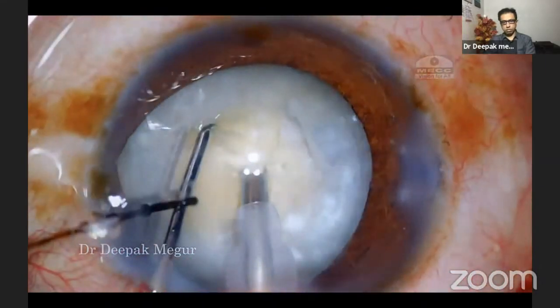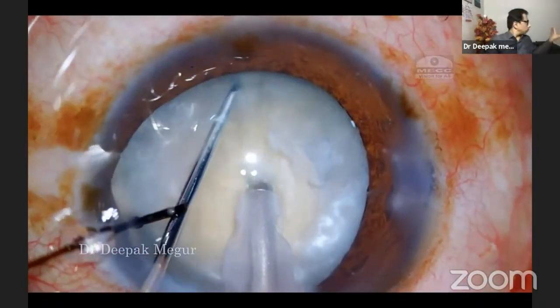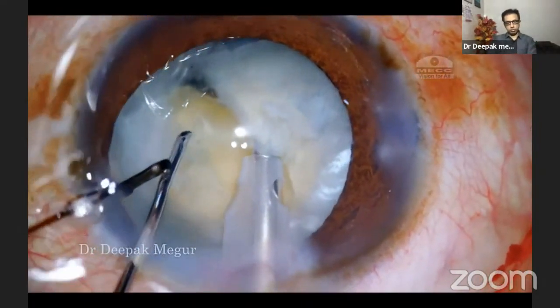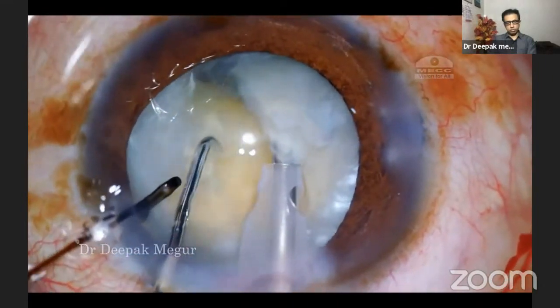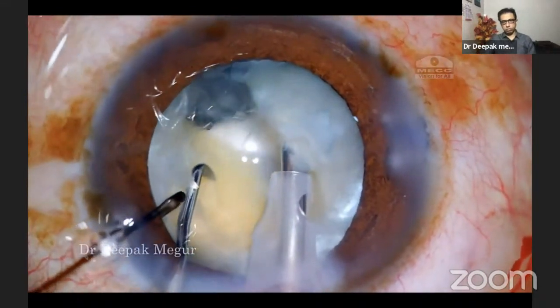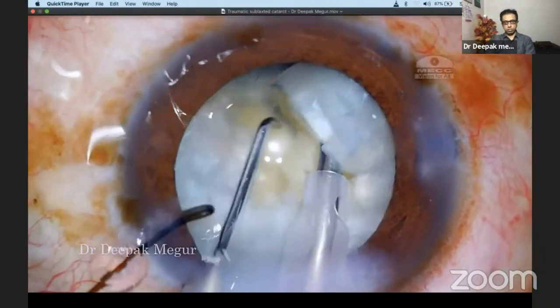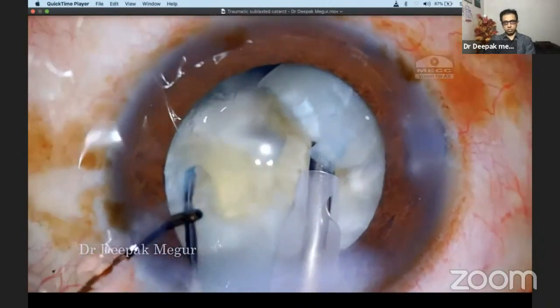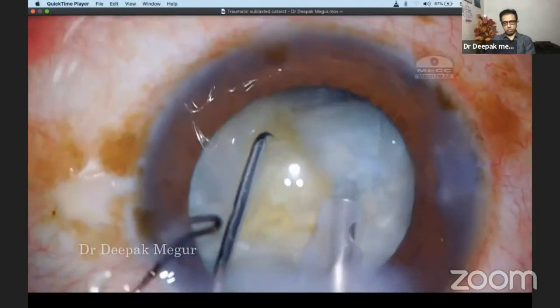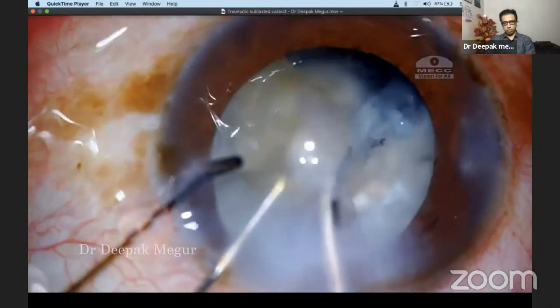My strategy is to do a direct chop. Once I bury the phaco tip into the nucleus, I'm trying to chop it and realize it's quite dense. My right hand is stable and I'm using my left hand to separate the nucleus and break the posterior fibers. The difficulty in eyes with these loose bags is that you don't have counter-traction, which is so helpful in separating fragments, because the tensile strength of the bag is not much here.